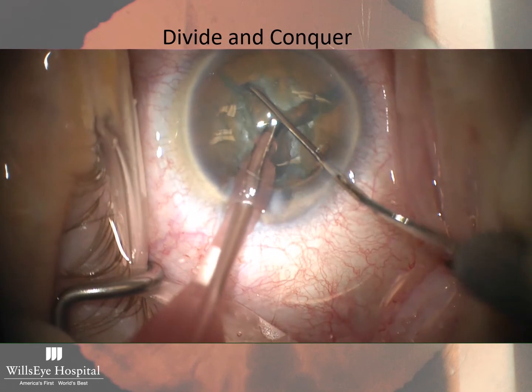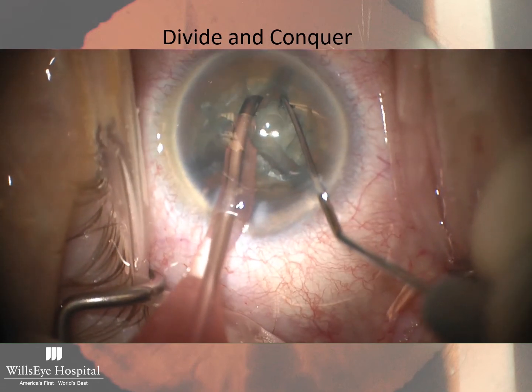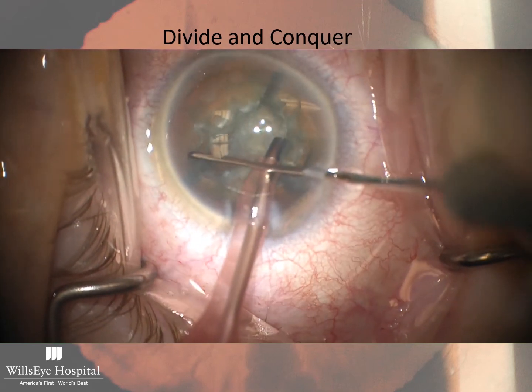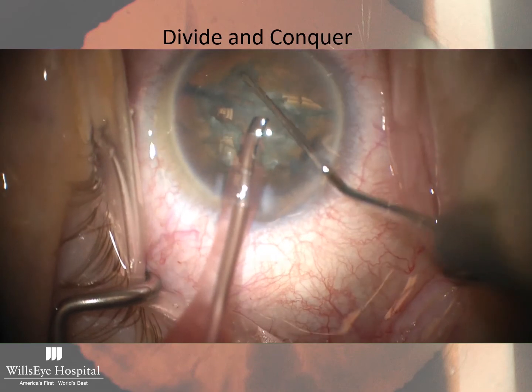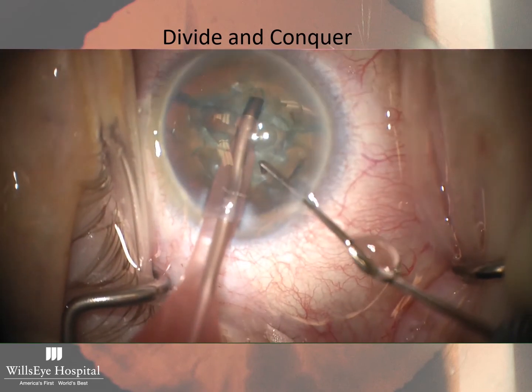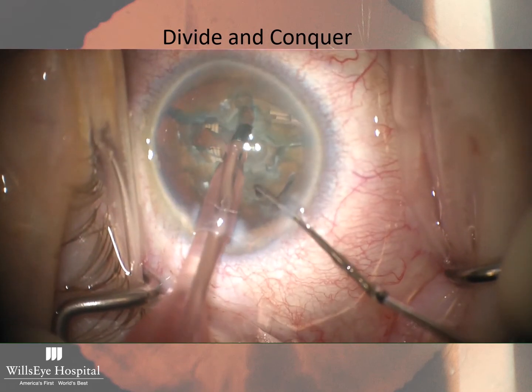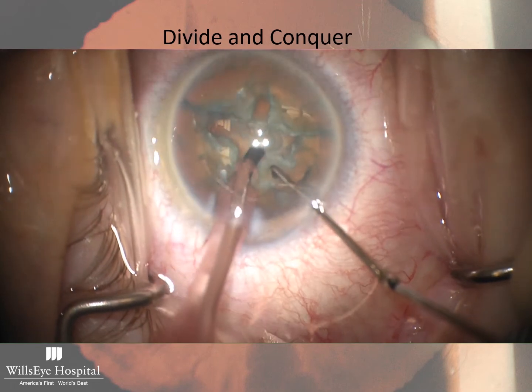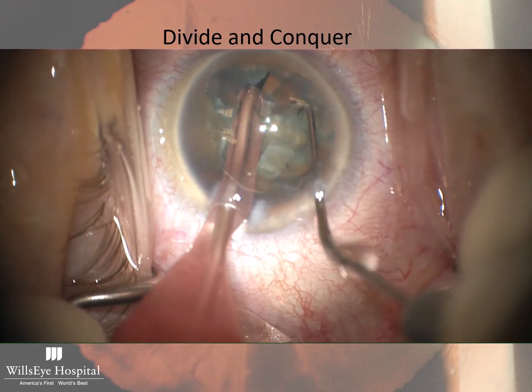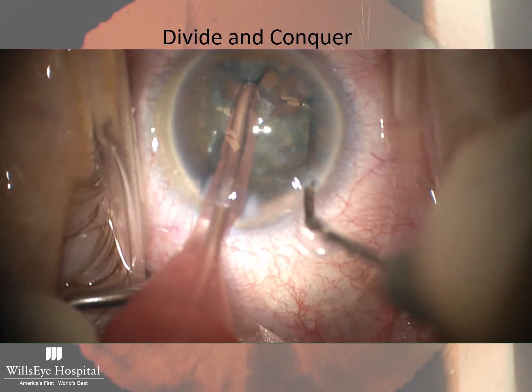Rotate 90 degrees. I'll spread this again to make sure. You always want to see that it spreads centrally. Otherwise, pieces are going to be locked in. And then again, grooving here. Now I know how deep I can go because I can see how deep it is with my crack. So I've gotten all four. I'm happy at this point in time. Now I can proceed to quadrant removal.